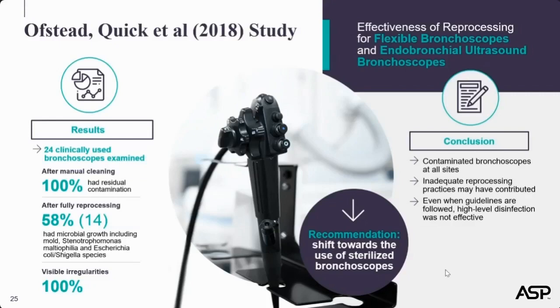The conclusion was that contaminated bronchoscopes were at all sites. Inadequate reprocessing practices may have contributed. Even when guidelines are followed, high-level disinfection was not effective. Ofstead's recommendation is to shift towards sterilization of bronchoscopes.